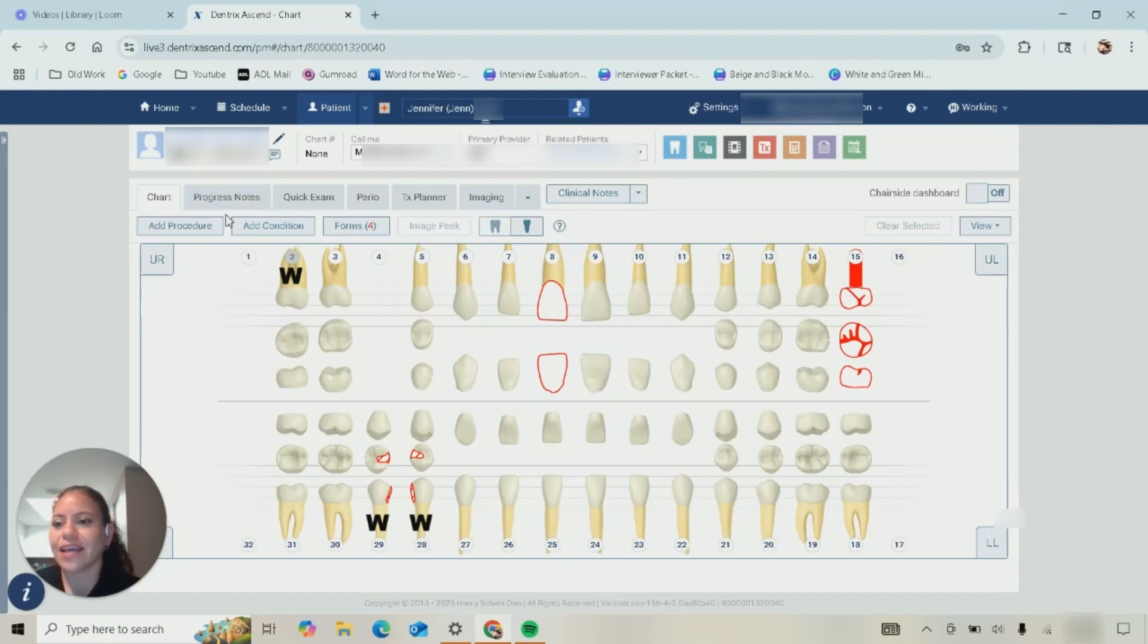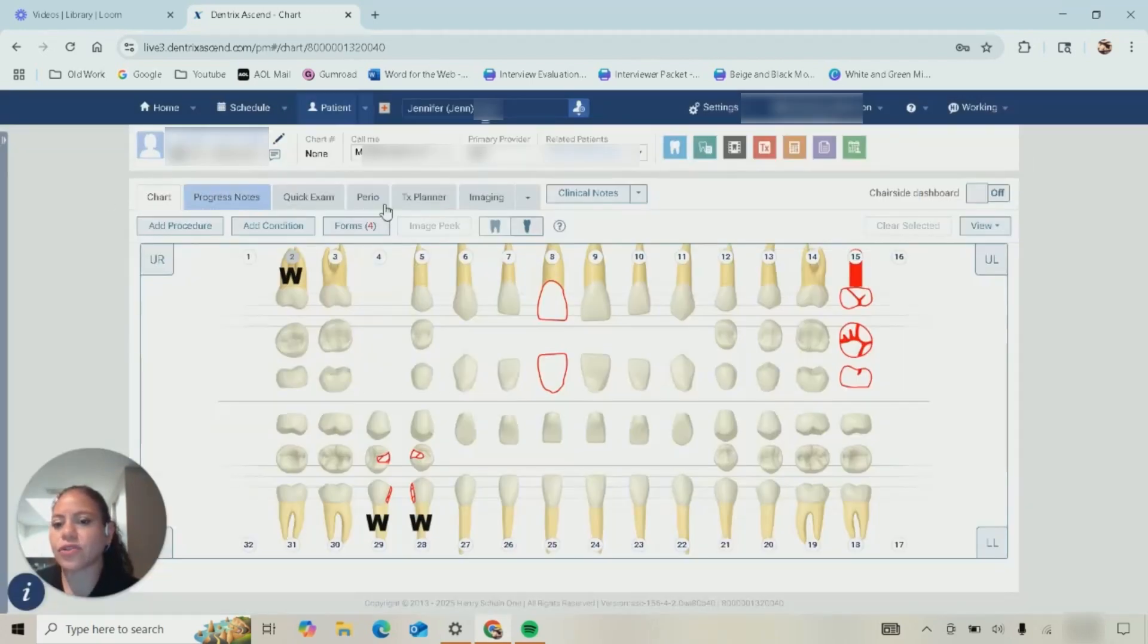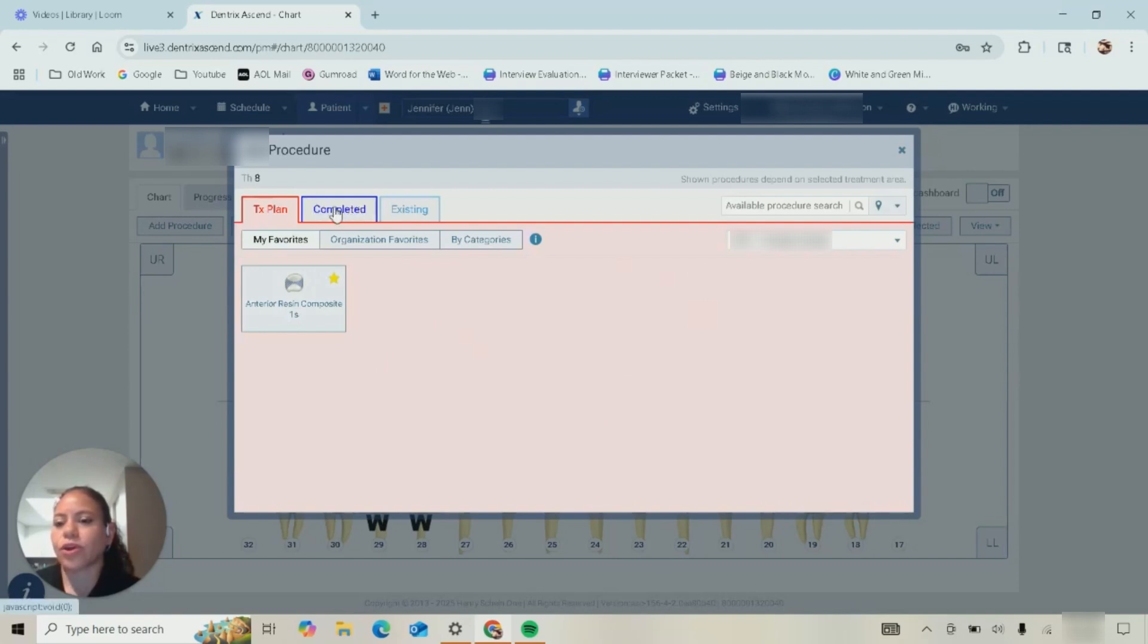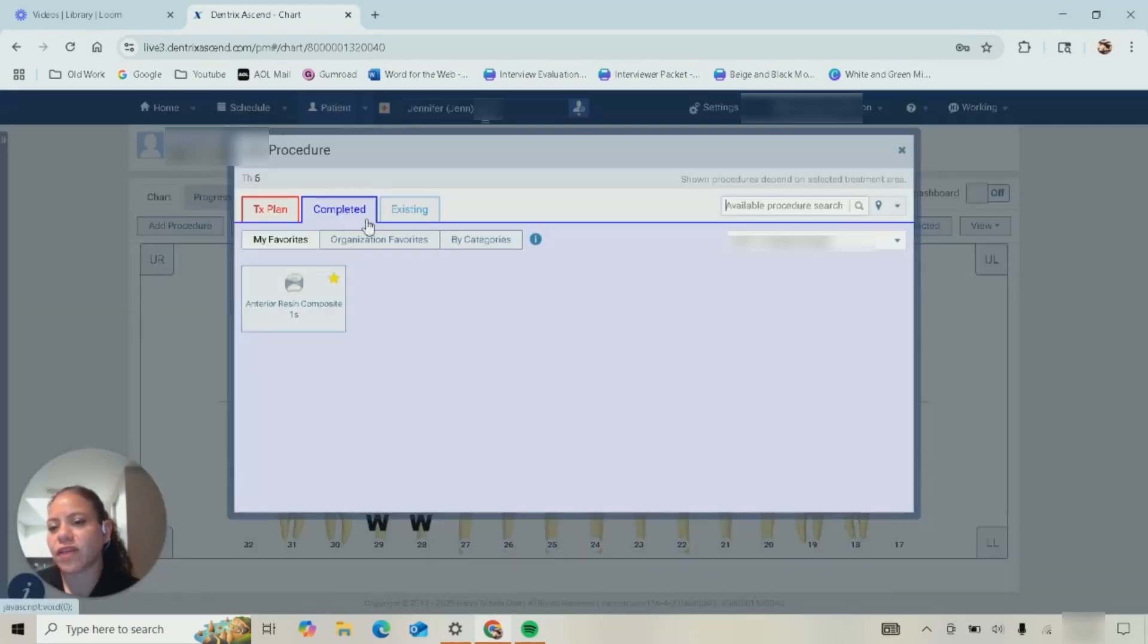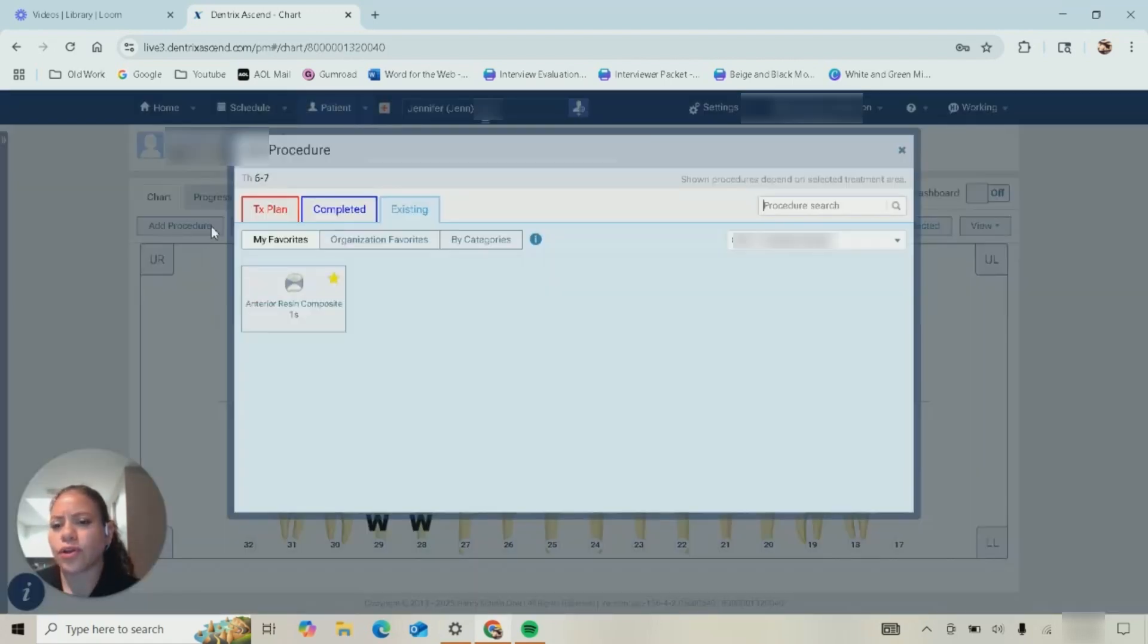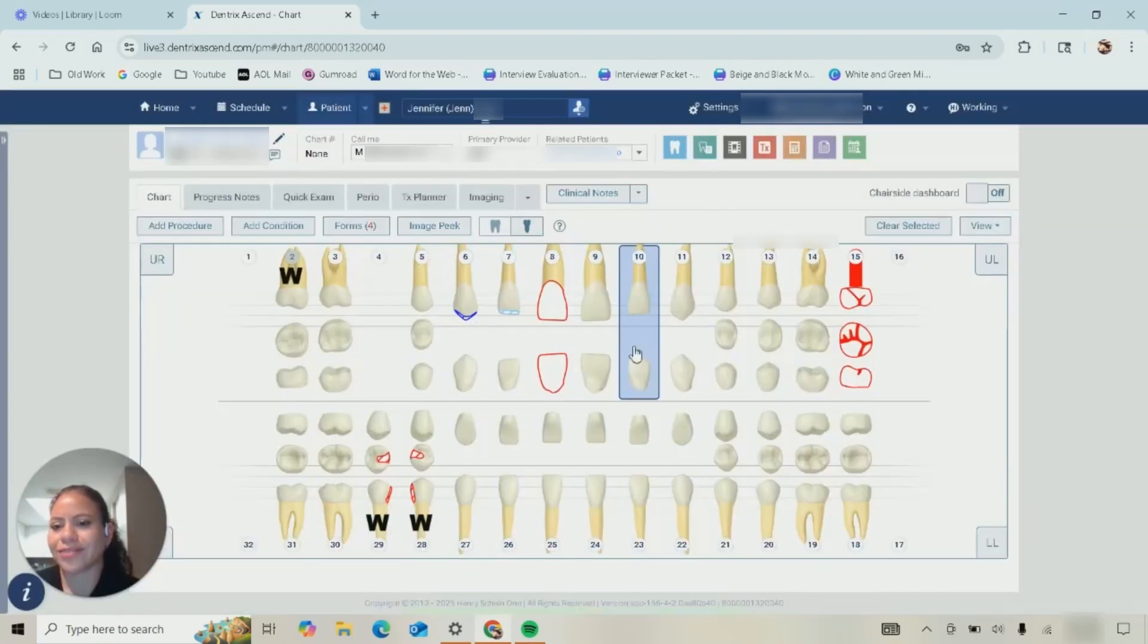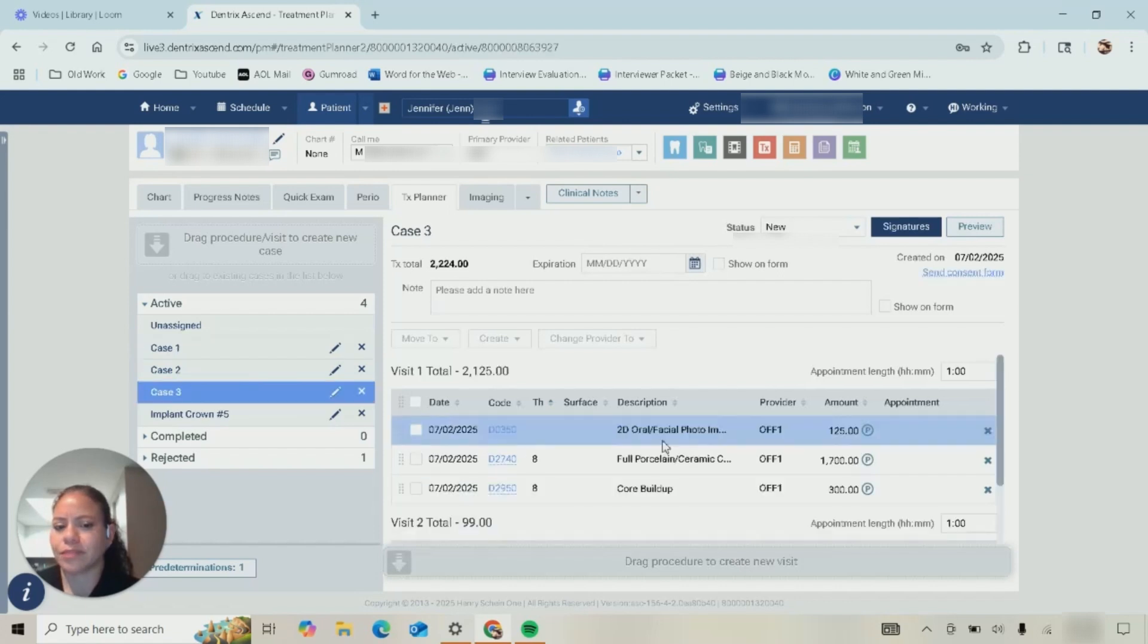Another thing I wanted to explain is the color. The color of the work is the color of the status, so the crown is red because I had that treatment plan, and as you can see here treatment plan screen is red. Any work that would be completed appears dark blue, and any work existing would appear this baby blue. So once again, treatment plan, existing, completed. If we were to have completed this crown, I can change the status here, complete it, and it's going to change to this dark blue.